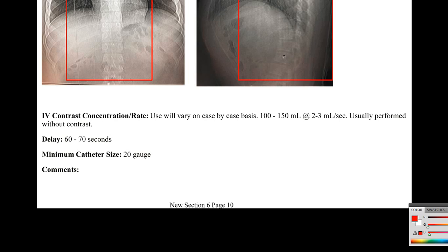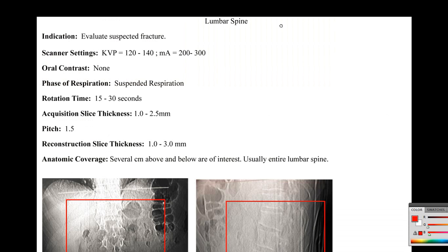And because of this high flow rate, or a higher flow rate than 1 milliliter per second, it'd be safe to utilize a 20 gauge needle. Many manufacturers say that a 22 can take up to 3 milliliters per second, but I feel that you'd be pushing it, so it's always better to utilize a 20 gauge if possible.